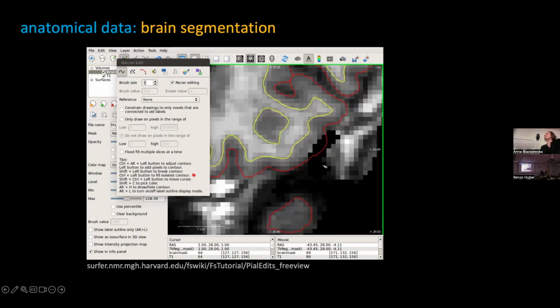Now, what's important here, in both cases, the brain mask, and also you'll see that soon in the white matter correction, we're actually correcting segmentations, and then we are letting FreeSurfer change the placement of the surface. So it's sort of like an indirect approach of moving things around.